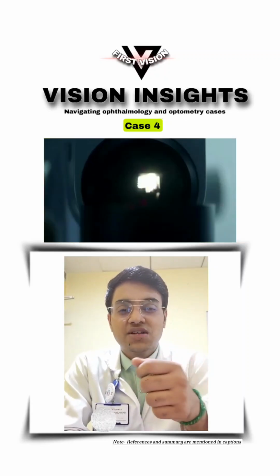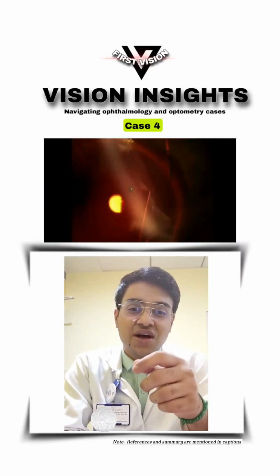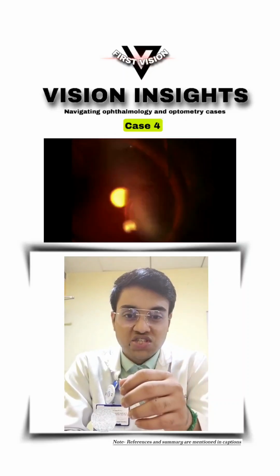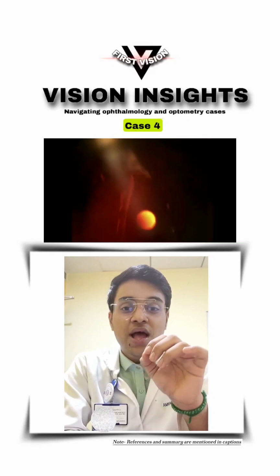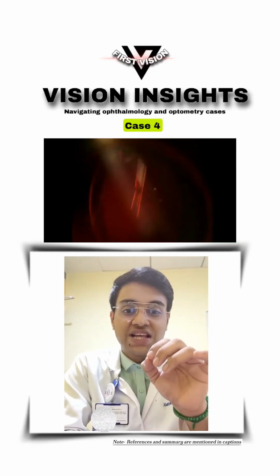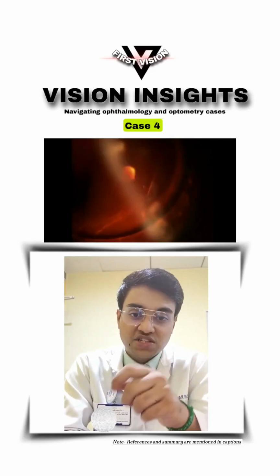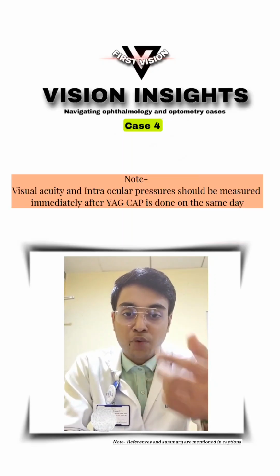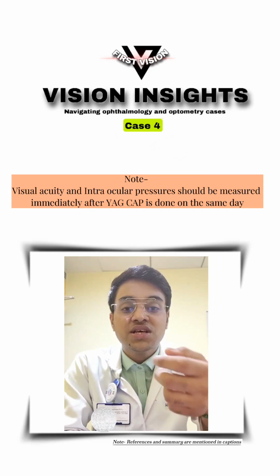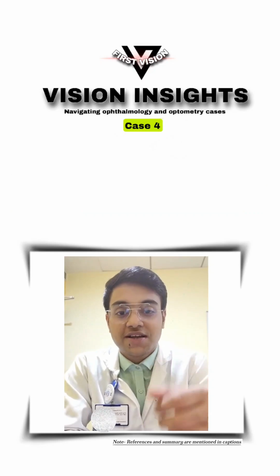The pre-requirements for such a procedure are usually minimal, as no general anesthesia is required for this sort of a procedure. The only requirement is the dilation of the pupil, and for ample pupil dilation, usually a tropicamide plus drop is preferred to perform this procedure. And then the patient is called for a 1 week post-procedure visit to check for the improvement in vision, glass prescription and ocular pressure monitoring.